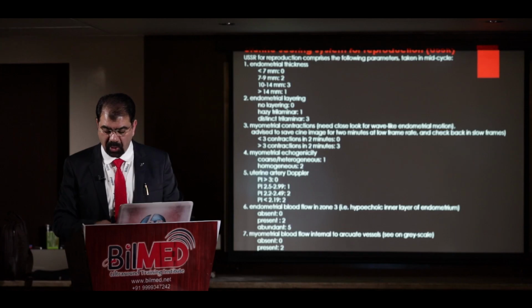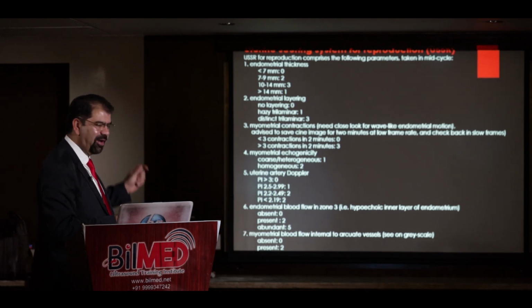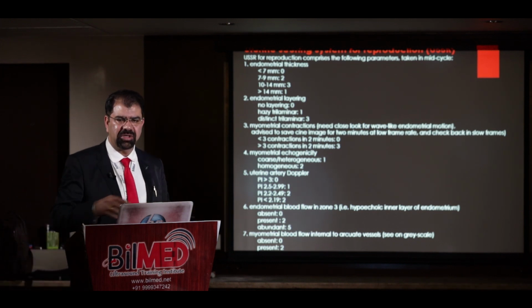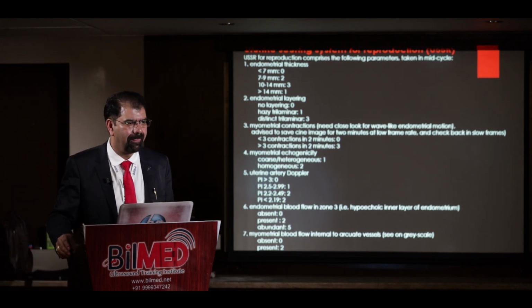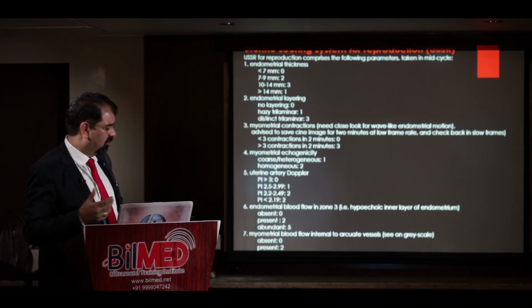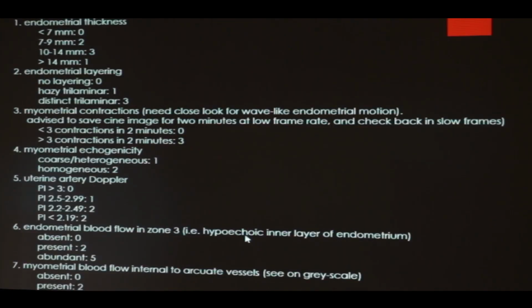Now see, the point here is not that you have to take one by one, then put a calculator on the right, then keep on adding these things. No, that is not my point. The point is what you have to see for. Now see, where is the follicle here? Follicle is not here at all.